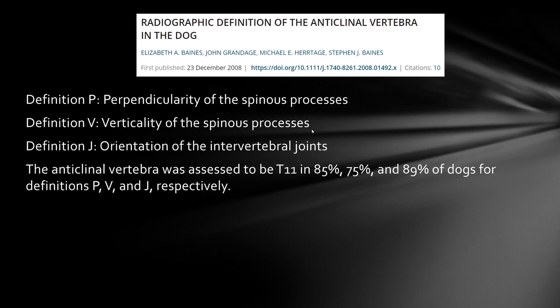Depending on what definition you use, it changes which vertebra you would be calling anticlinal. I never thought about this being a problem at all, but it is probably because I always used perpendicular to the long axis of the spine as my definition. I wasn't even aware that some people might be using other definitions. So just be aware that there are people maybe thinking in a slightly different way than you are.